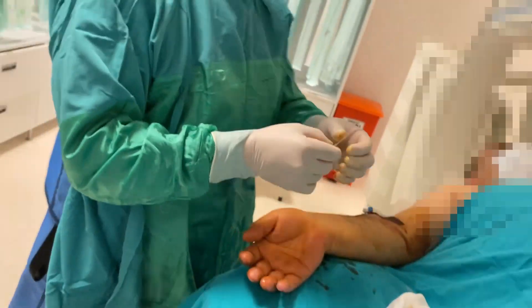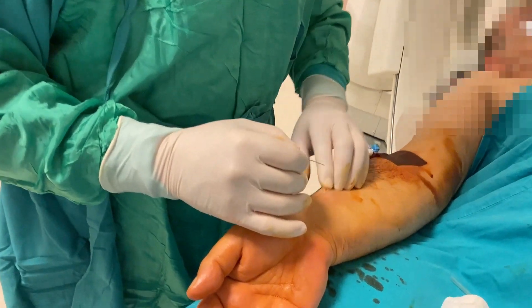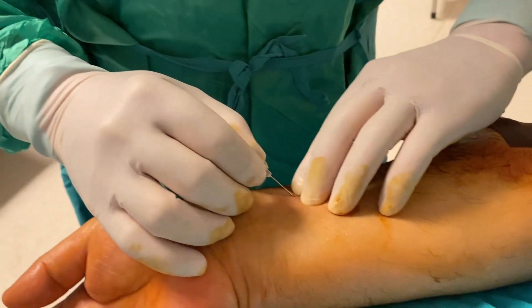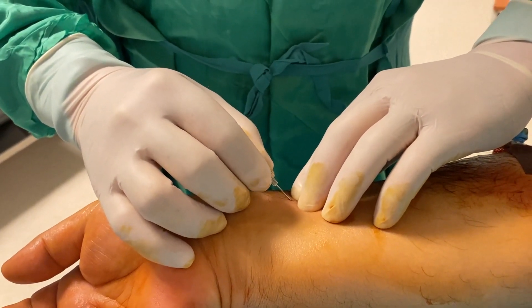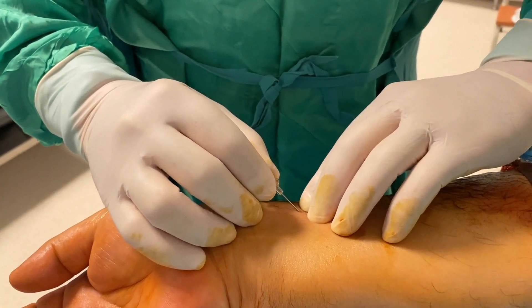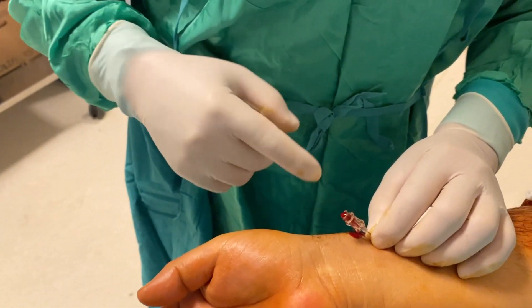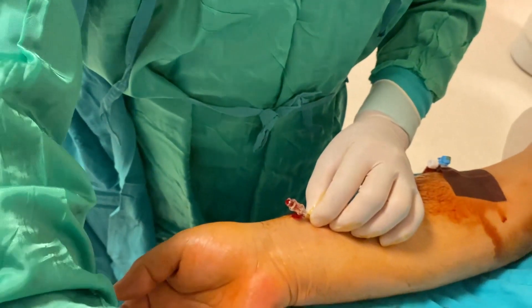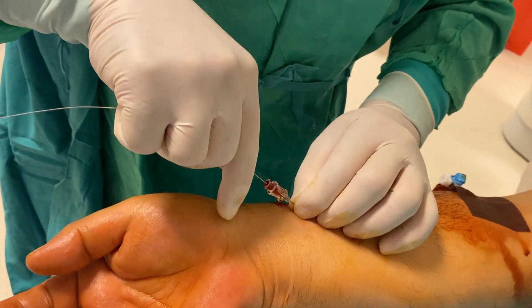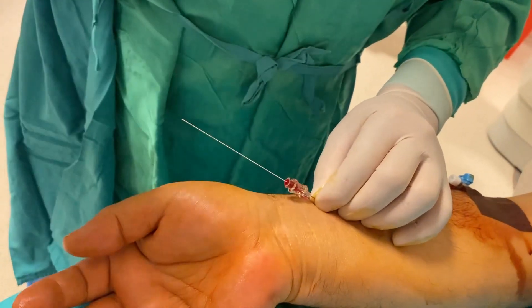Uyuşturduktan sonra atar damarı burada palpe edip şu kılavuz iğnemizle düz bir yerini bularak içeri gireceğiz. Gördüğünüz gibi buradan kan gelmeye başladı. Gelen kan da nabız şeklinde geliyor. Tabii ki atar damarda olduğumuzu böyle anlıyoruz.